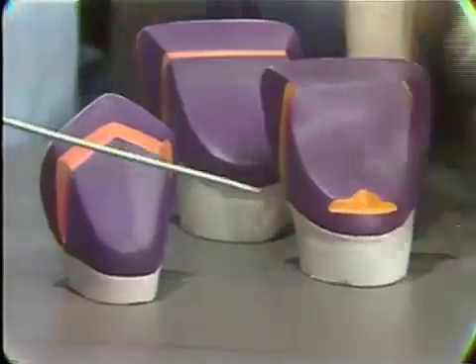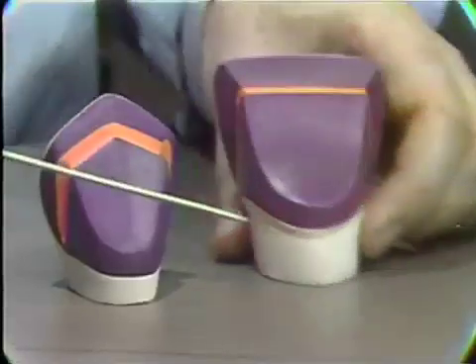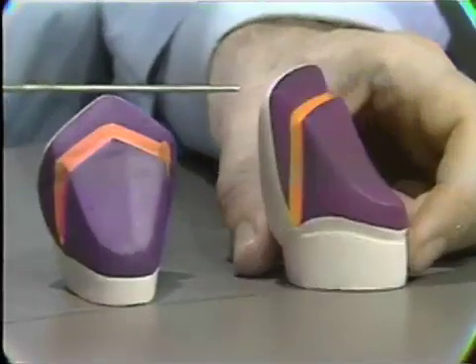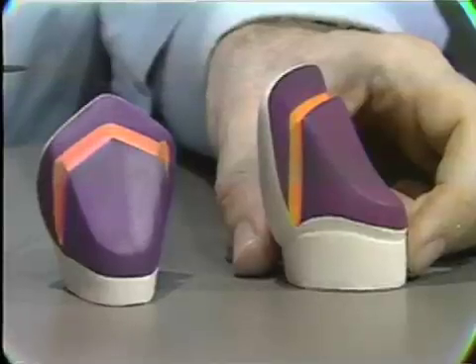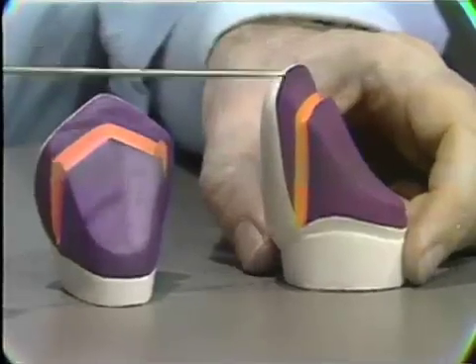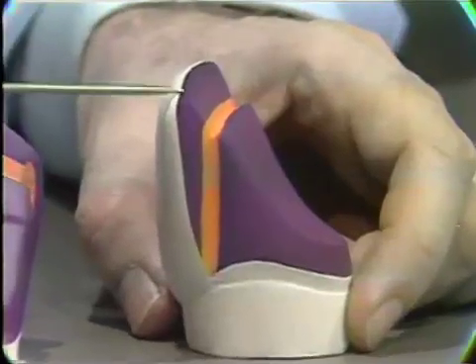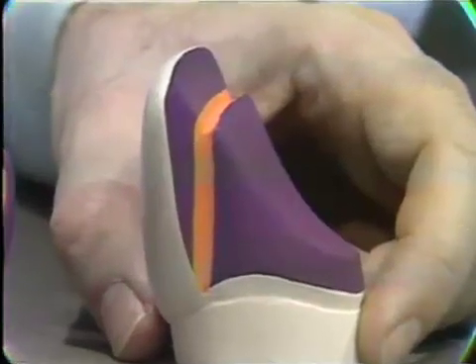Here's another three-quarter crown on a maxillary incisor of the more standard type, with both proximal grooves and an incisal groove running across. Notice the protection of the incisal edge here, which is kept to a minimum so as not to interfere with the labial aesthetics of the tooth.